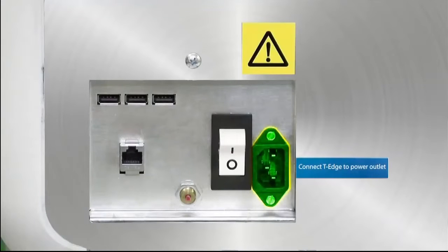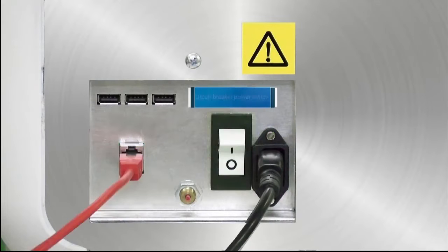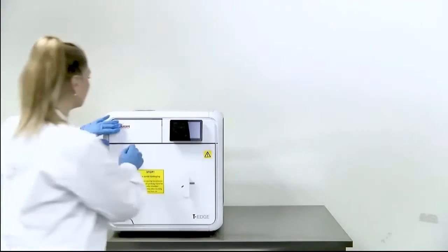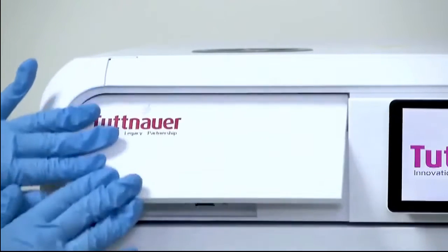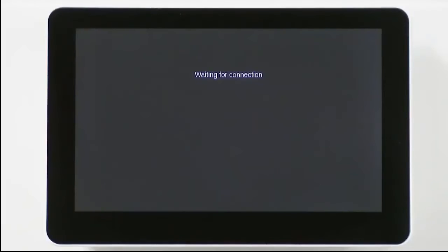Connect T-Edge to the power outlet, then turn on the back power switch. Switch on the front power switch and wait for the system to power up until the user interface is displayed.